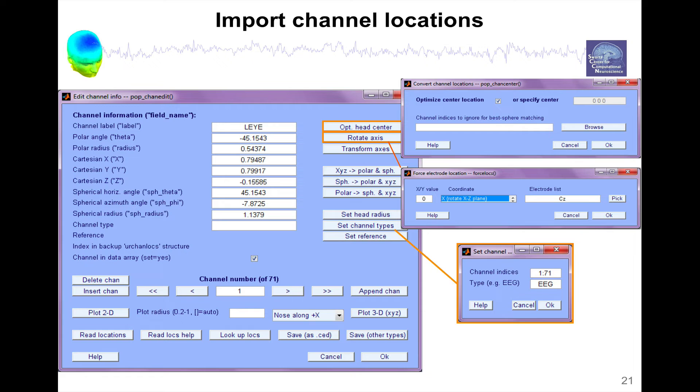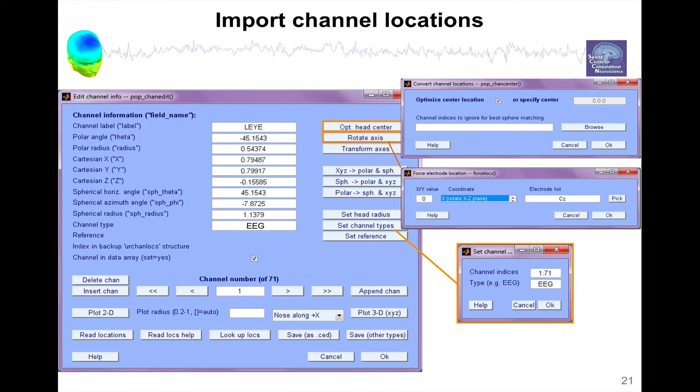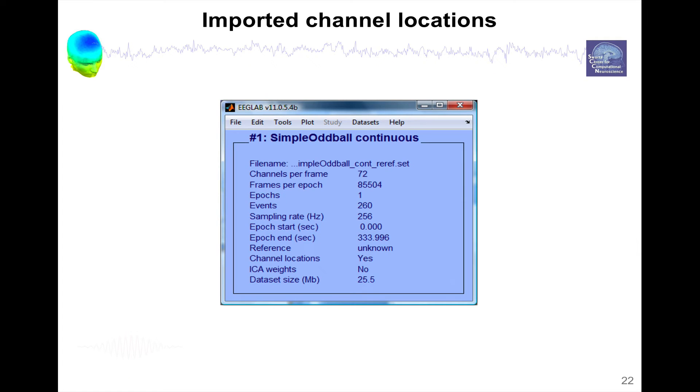And then you can also select the channel types. If you have only EEG channels, you can set them to all the EEG channels. Or if you have autonomous channels like heart, respiration, you can also assign them different types. There's specific types for different types of channels. And this is useful, for instance, when you're filtering data, you can select different types or for all the types of processing.